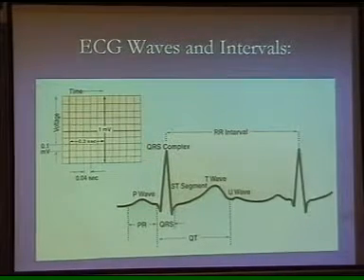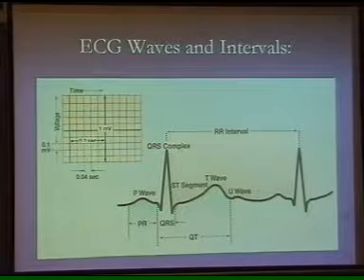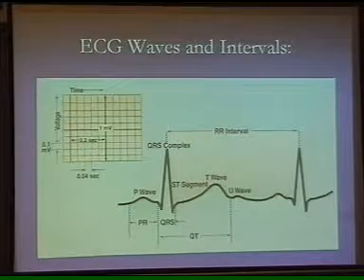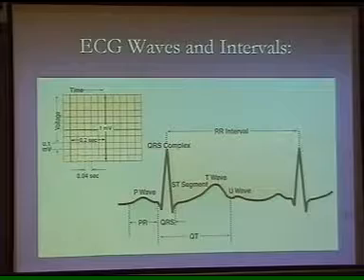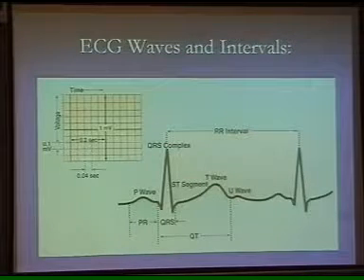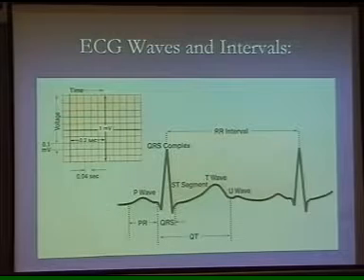But you have to look at the polarity of the P wave as well, whether it is upright or downsloping. If it's upright, it should be upright in 1, 2, 3 and AVF, because that's the cardiac axis coming in at the 5 o'clock position. Cardiac axis is from the right arm going towards the left foot. So the inferior leads that are looking from that side, the cardiac vector is basically pointed towards them, and they will register a positive deflection.